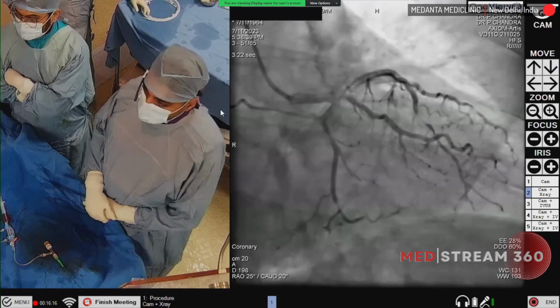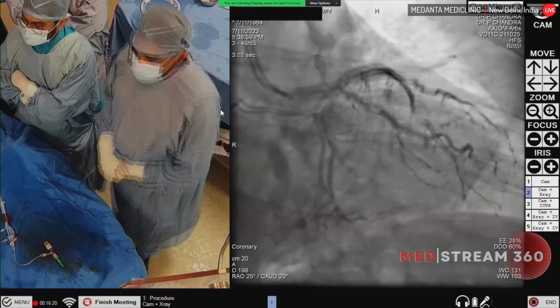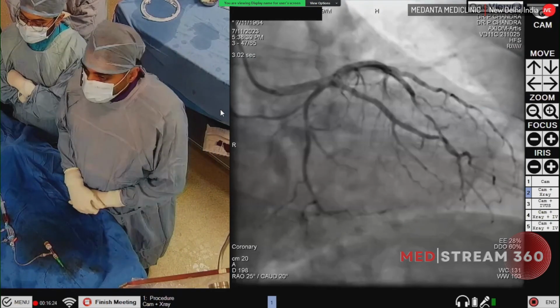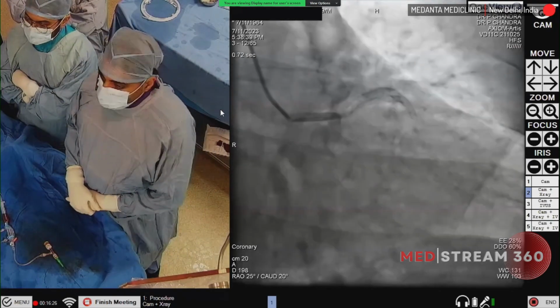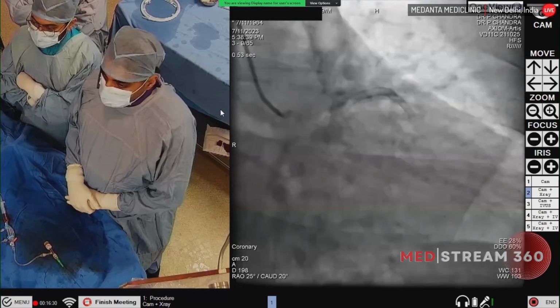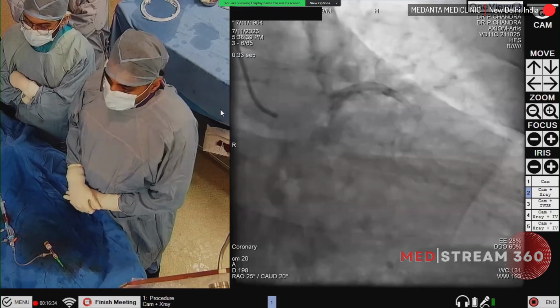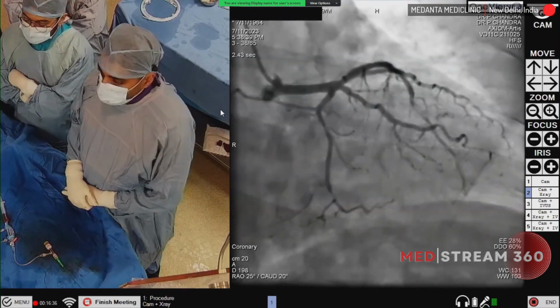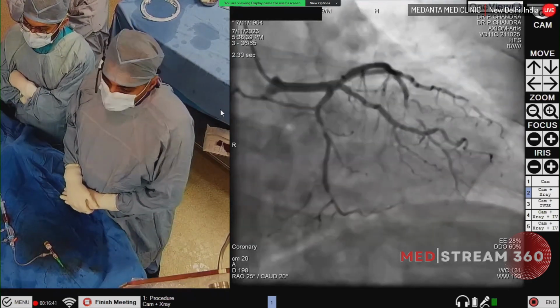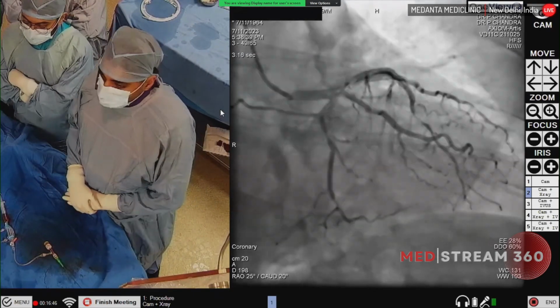Our patient is a 59-year-old gentleman with a past history of coronary artery disease, had a PTCA done in 2013 to LAD and D1 bifurcation. At that time, he presented with angina and he underwent this procedure long back. And he was doing well till 7 days back when he had an episode of unstable angina and he was diagnosed as inferior posterior wall MI in the hospital where he was thrombolized and was stabilized for the next 24 hours, and then he was presented to us.